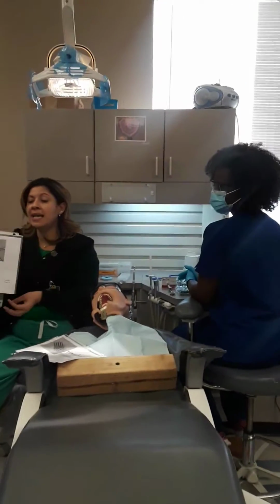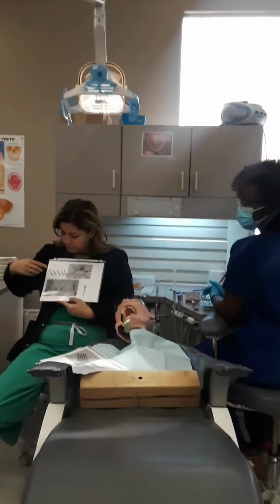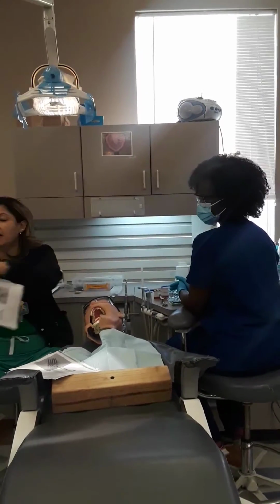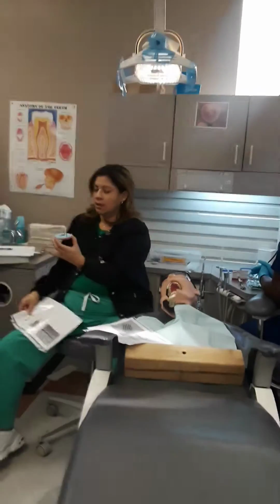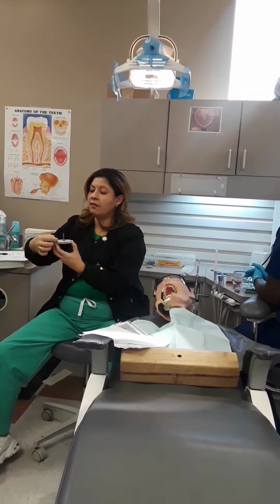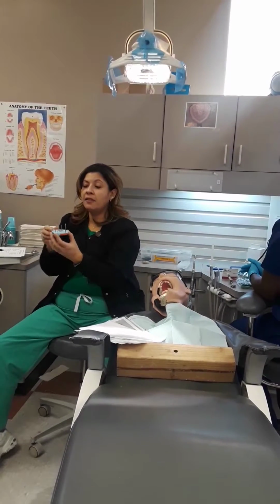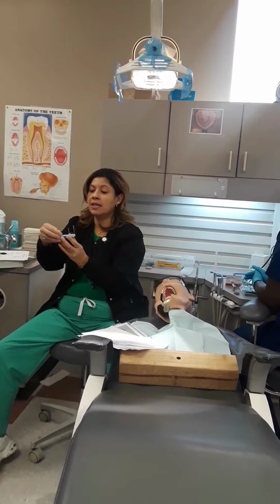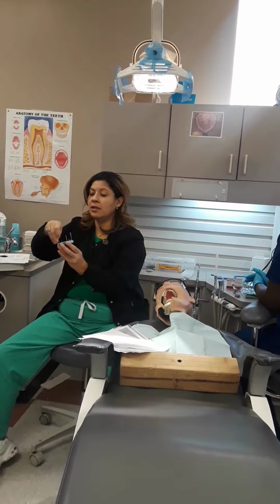And then this page is our finishing. So we've got finishing burrs here. They're usually gold. If you look at my burr block, these two here that I'm moving right now are our finishing burrs. The flutes are what change it. This is my cutting burr, this one as well. These are all my cutting burrs.